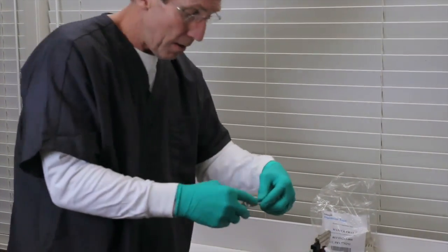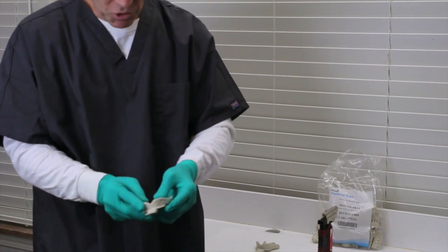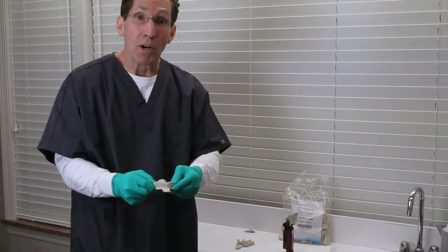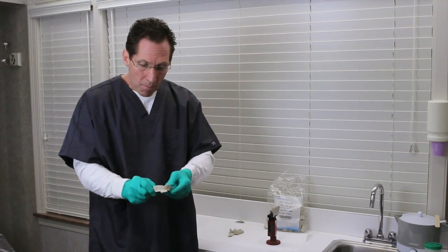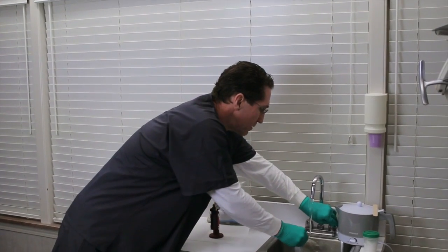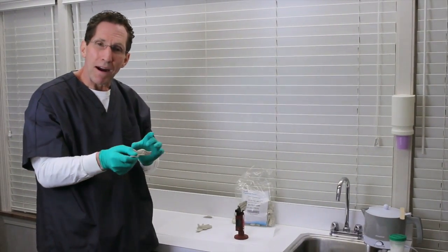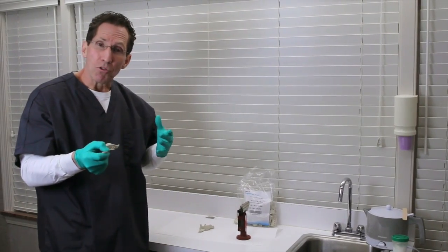So I'll heat them, and as you can see here, it becomes kind of pliable. And typically I will take that labial portion, bring it back a little bit and widen. How much I will widen will obviously depend upon the patient's situation. Do they have exostoses, tuberosities, tori, whatever. We'll modify that, and then we'll just cool it off in the water. And then we'll take this again to the patient's mouth, verify that we have adequate room. We'll do whatever modifications we need to this way in almost every case.